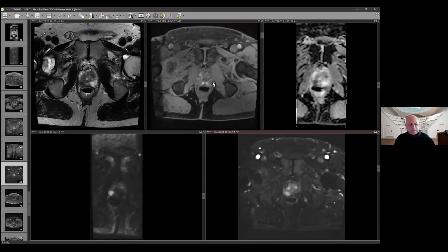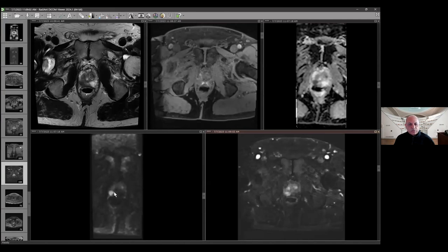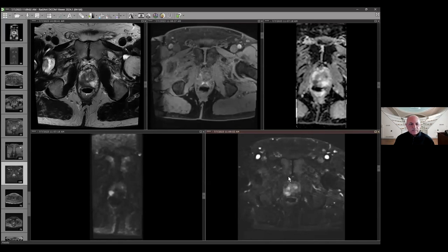One other point: when our high B-values were not as high — about a decade ago, typical B-values were in the range of 800 to 1000 — we relied more on the ADC dark signal than the high B-value. Now with high B-values close to 2000 or even 2500, the confounding issue of hemorrhage causing problems is less of an issue — you can clearly see through hemorrhage within the peripheral zone and identify the tumor. The take-home: if you end up doing DCE, make sure you do subtractions, which you always should whenever you give gadolinium — you can nicely see the lesions against the backdrop of bright signal. Clearly there is restricted diffusion here. I'll stop there as it's 12:54.